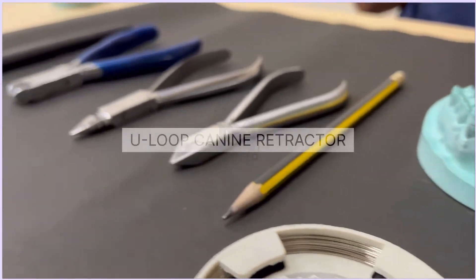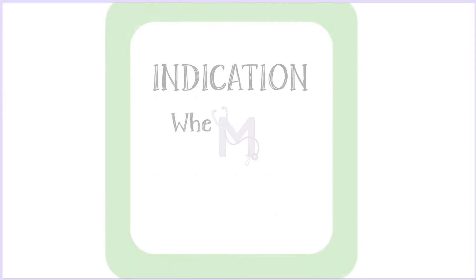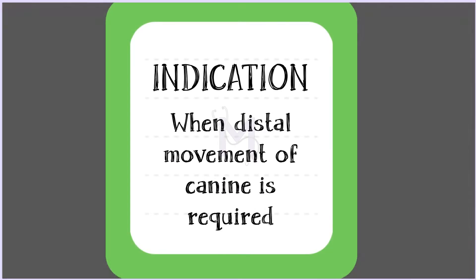In this video, we'll learn how to make a U-loop canine retractor. A U-loop canine retractor is indicated when distal movement of the canine is required.